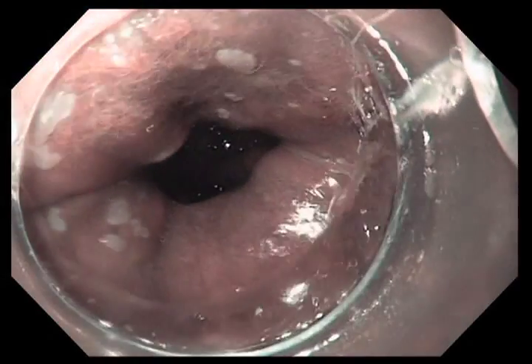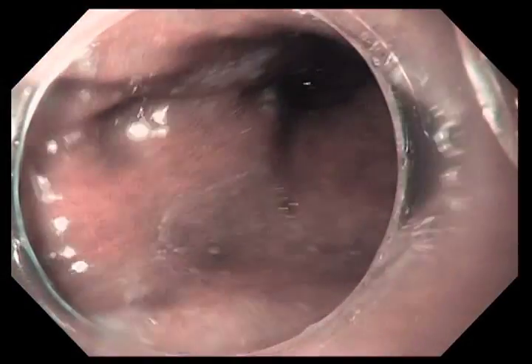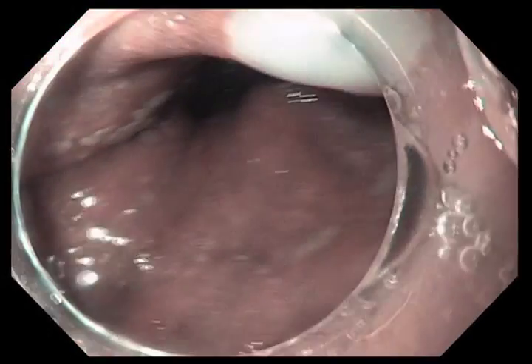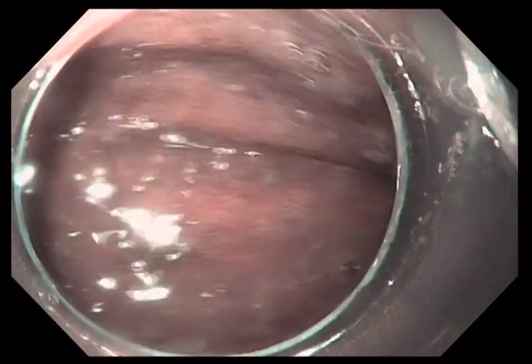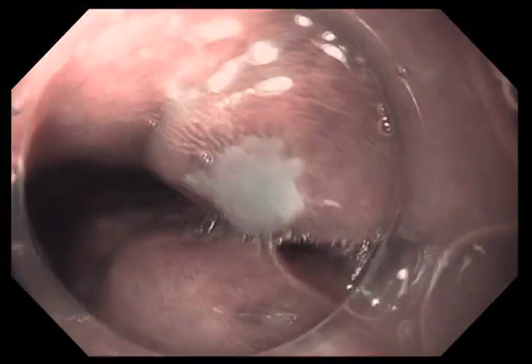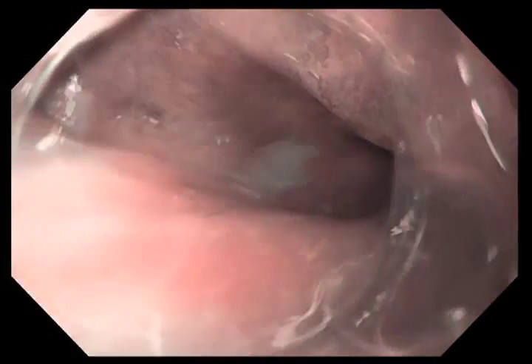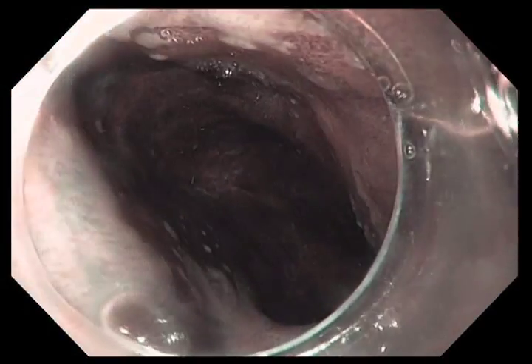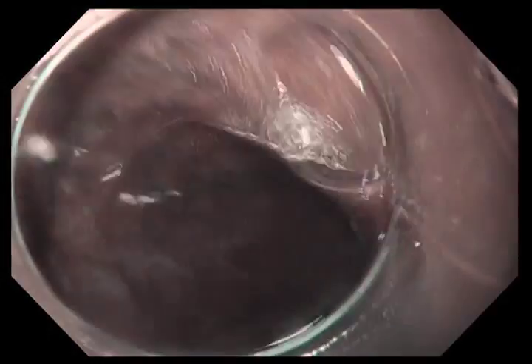We've just switched to NBI. The narrowband imaging technology filters light in a way that blue light is the main light used. This highlights the blood vessels in the epithelium, and by highlighting the blood vessels we can get a better idea of the vascular and mucosal pattern. What we're looking for are areas that might show high grade dysplasia.